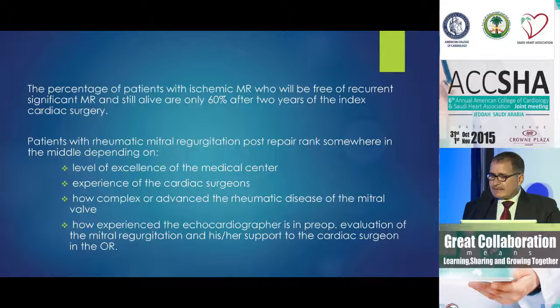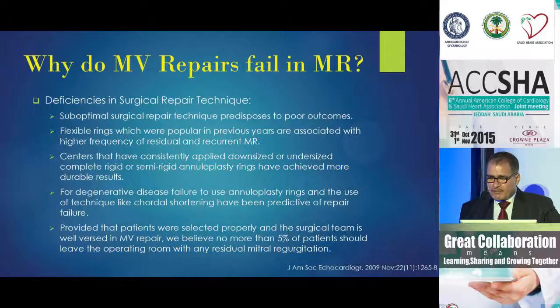And I have to say that maybe we have to do better in different aspects of repair, not only from the surgery side, but also the cardiologist, who should give more information about the mitral valve pathology, where the pathology is, and how to improve the technique and the results post mitral valve repair. I will go back. I just want to show some. If you give me just 1 minute, please.